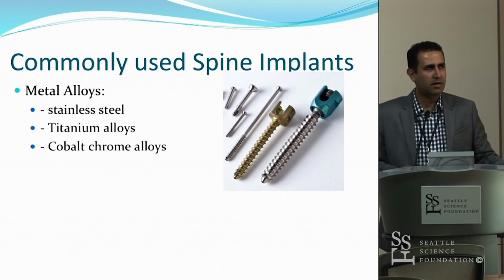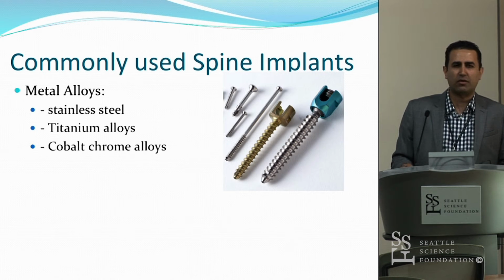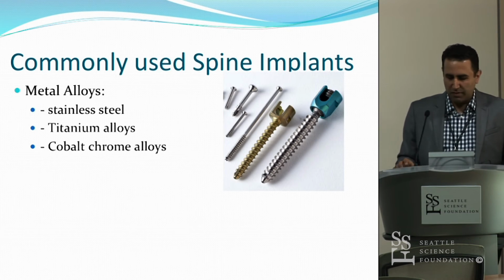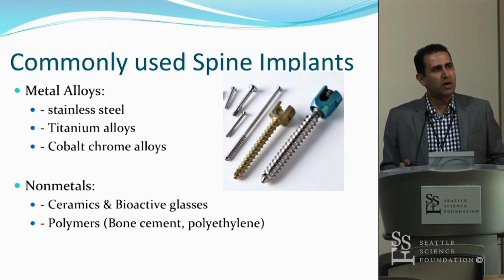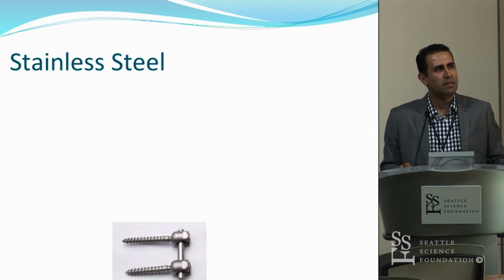We'll actually tackle that. I've got a slide on interbodies, carbon fiber, and it's really interesting. The one problem with PEEK in particular as a rod is that you can't use it for deformity correction because it's not stiff enough, so it'll give way. But for a segment or two, it's great. So as we said, ceramics and PEEK are the other non-metals.